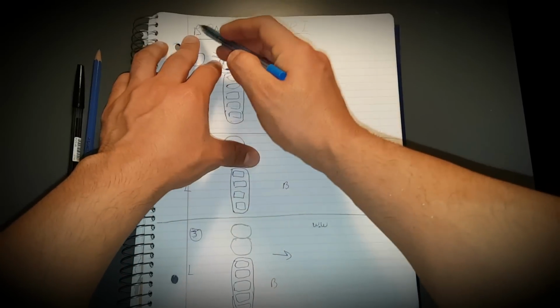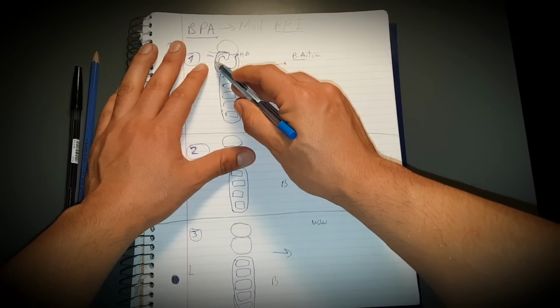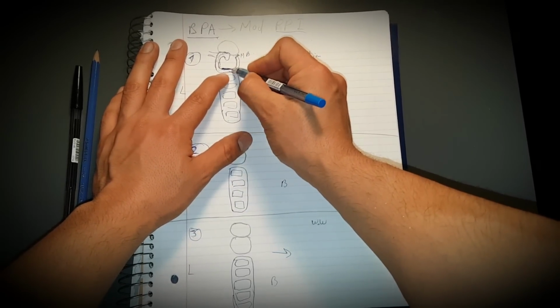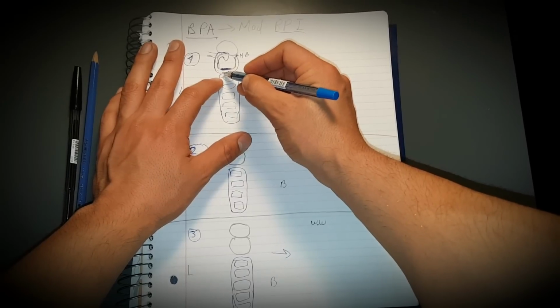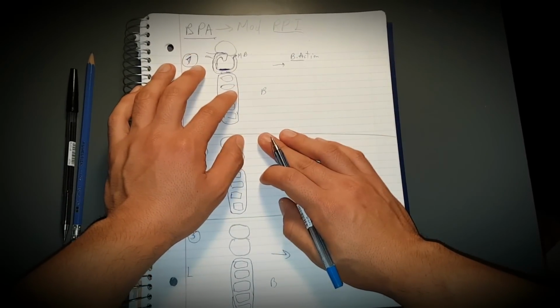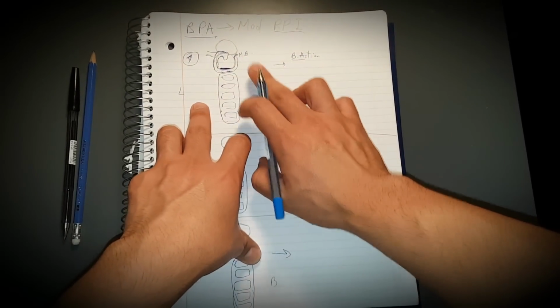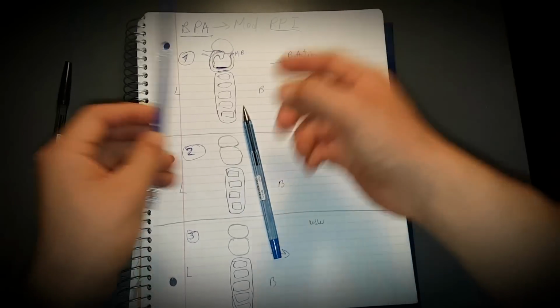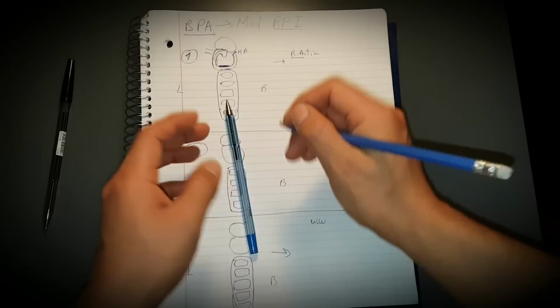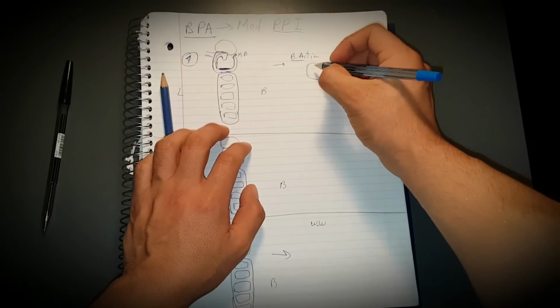Okay, so RPA means we have a mesial rest, it comes here, then it contours the whole tooth, and then this distal part turns into a guiding plane, so it's all flat, and then it continues and engages the mesiobuccal undercut. So now we say, hey, wait, this looks like a back action. Do not get confused. A back action is pretty similar. You can even say that an RPI in this position works as a back action. But the back action ends here.